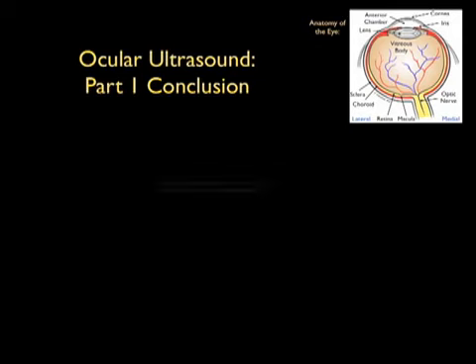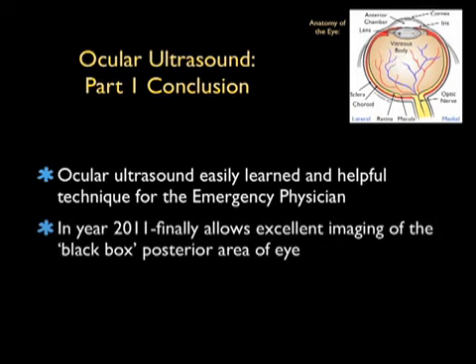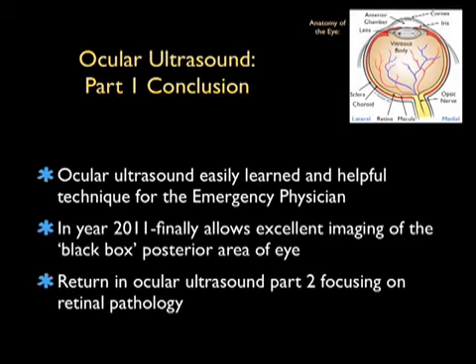In conclusion, thanks for tuning in to part 1 of Ocular Ultrasound. I hope I've been able to drive the point home through this module that ocular ultrasound is an easily learned and very helpful technique for the emergency physician, and in the year 2011 finally allows excellent imaging of that black box posterior area of the eye.